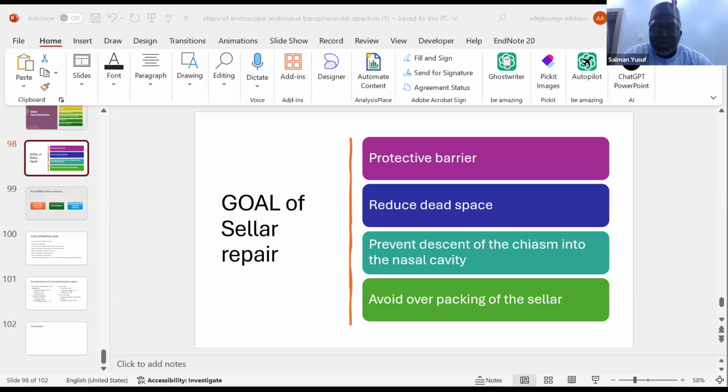No. You can do a good transsphenoidal surgery without even the ultrasound. So in the center where it's available, people use neuronavigation. That's a luxury. If you don't have it, I think you should just go ahead. And they have given all the steps.